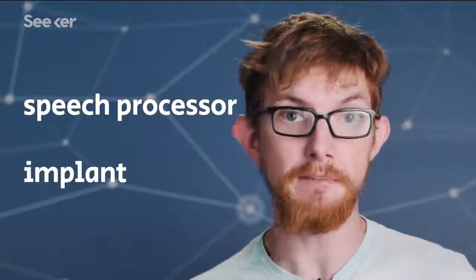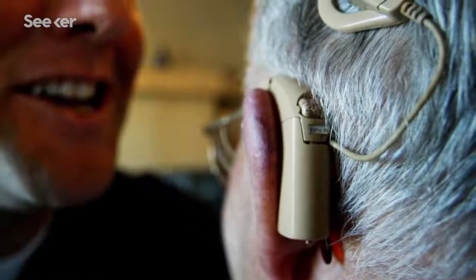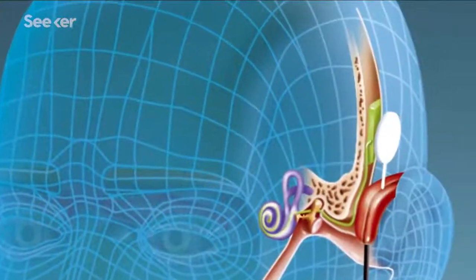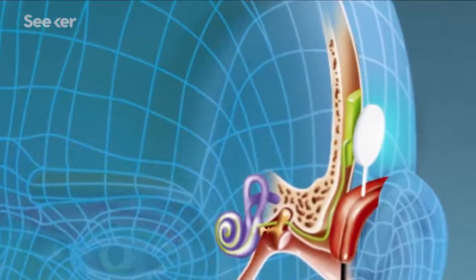Instead of getting the outer and middle ear to transmit sound waves like a hearing aid does, a cochlear implant goes straight to the finish line. It consists of 2 parts, a speech processor and the actual implant. The speech processor sits on the back of the ear and is just what it sounds like. It takes the sounds it hears and converts them to electrical signals. Those signals are sent to the implant, which rests under the skin and connects to the speech processor outside via a magnet. The implant has a long array of electrodes that actually curl up inside the cochlea, and when these electrodes go off, they trigger the nerve cells like the hair normally would.